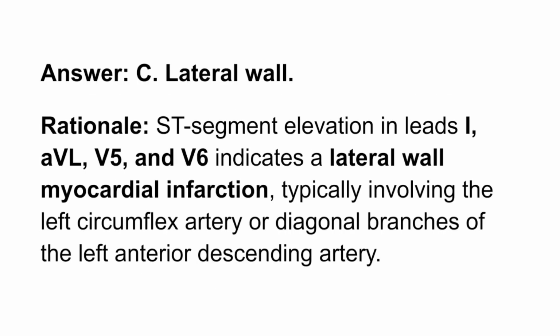Answer: C. Lateral wall. Rationale: ST segment elevation in leads I, aVL, V5, and V6 indicates a lateral wall myocardial infarction, typically involving the left circumflex artery or diagonal branches of the left anterior descending artery.